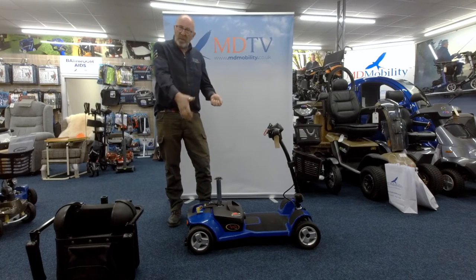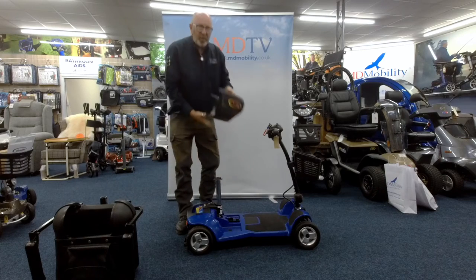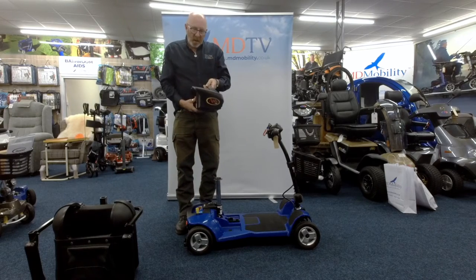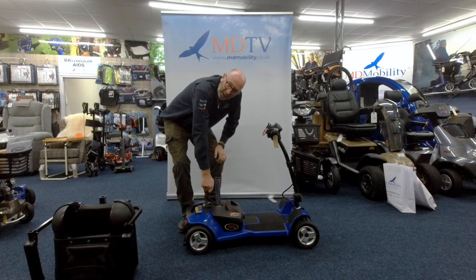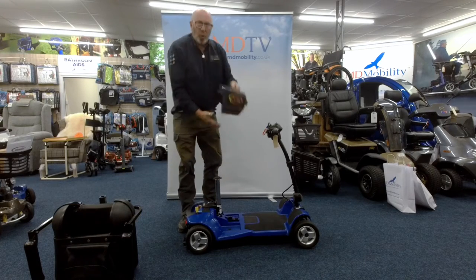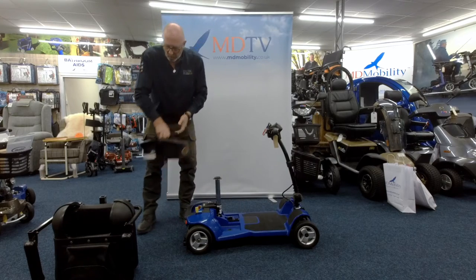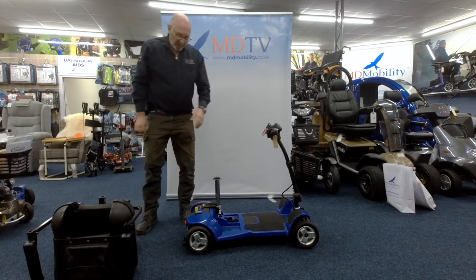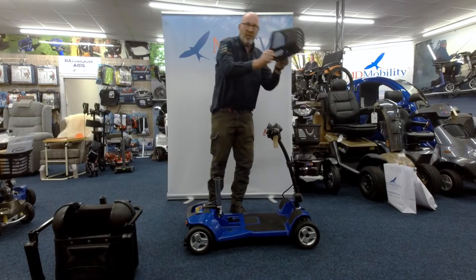On some other scooters you might have to lift a handle underneath the seat, but on this particular one your battery just lifts straight out as well. On some other scooters there might be a little catch or a locking device to hold the battery down; on this one there isn't. So you lift your battery out — again, put it somewhere where you're not going to reverse over it and fall over.